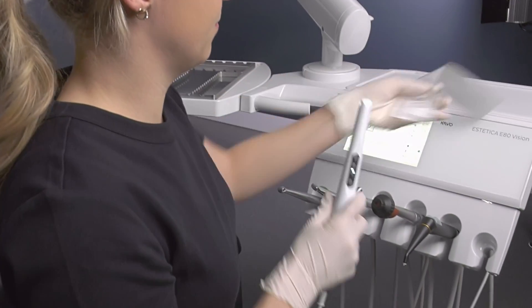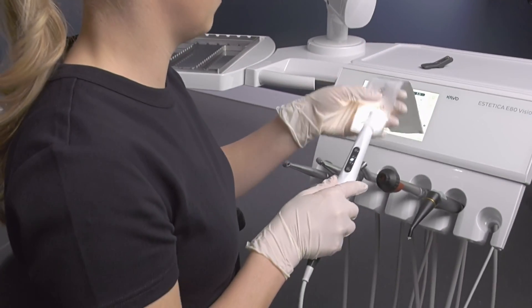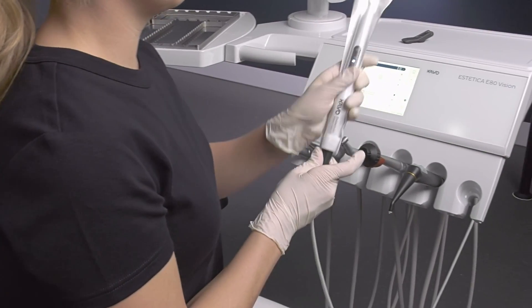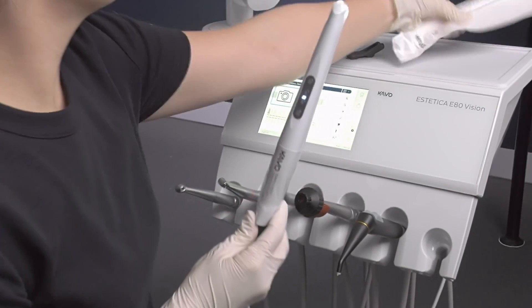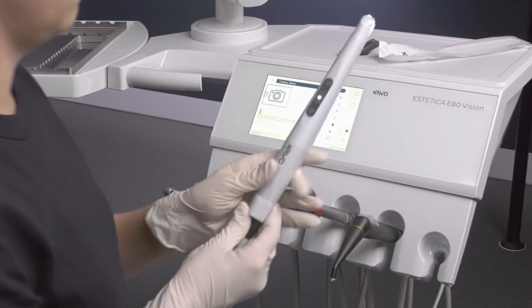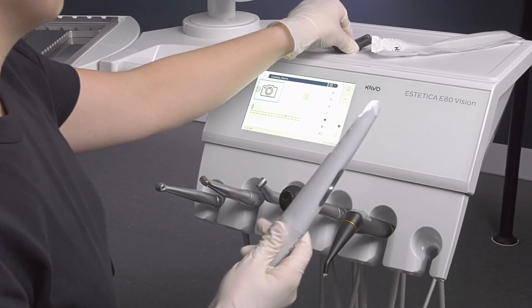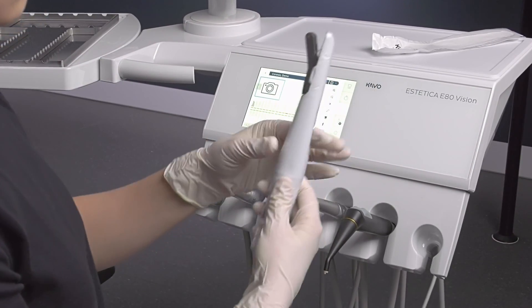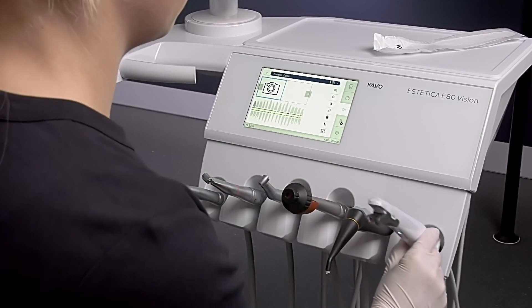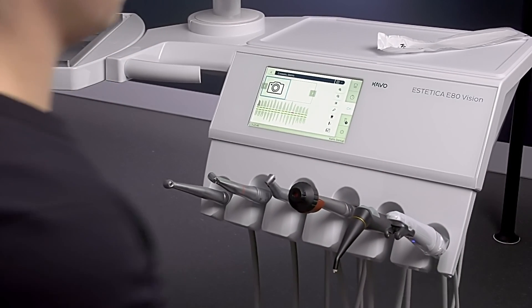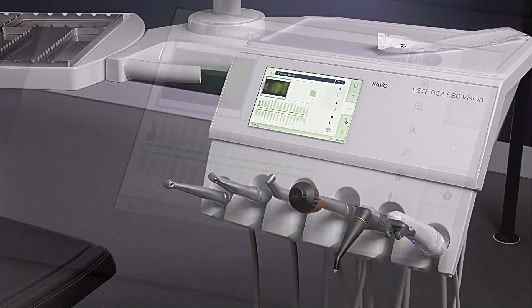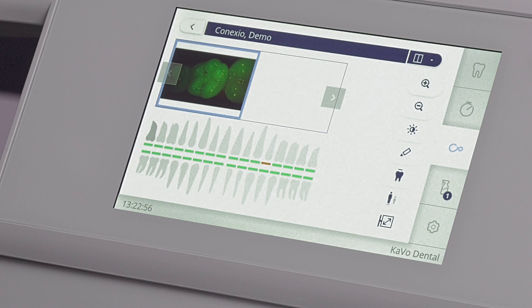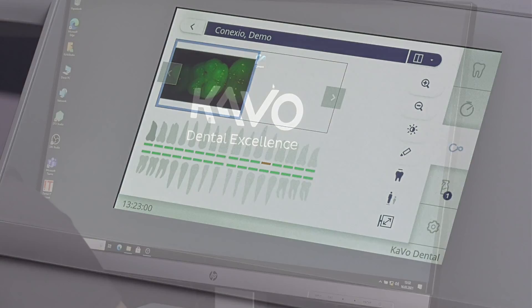The KaVo CONEXIO software is used for communication between the dentist and patient while using the KaVo treatment unit. With the help of this software, data created digitally can be saved in the specific patient's file and pulled up directly on the KaVo treatment unit for the purpose of patient education. CONEXIO also allows you to access all of your VDDS compatible software images on your KaVo treatment unit.